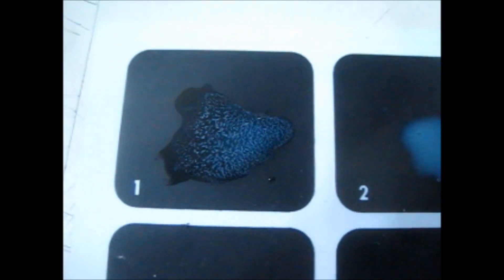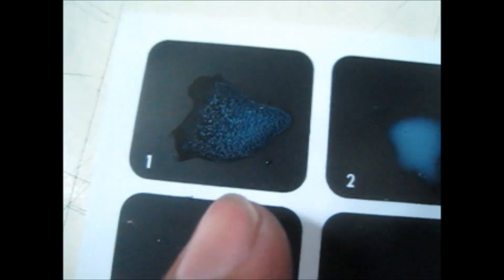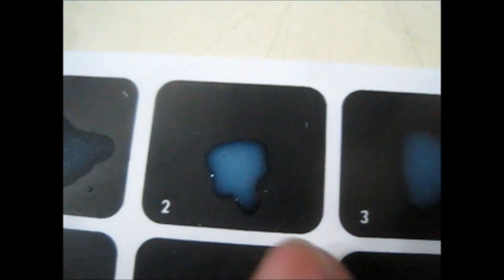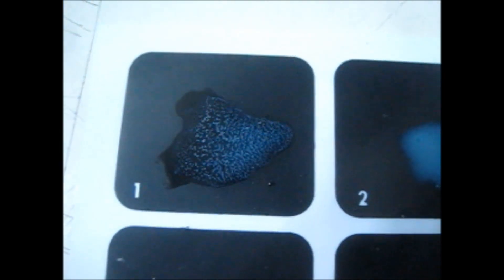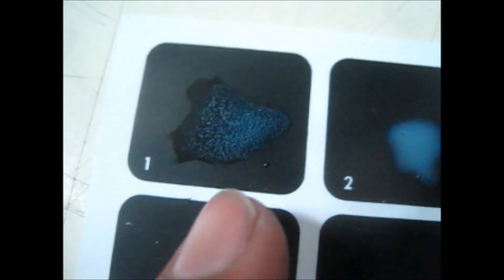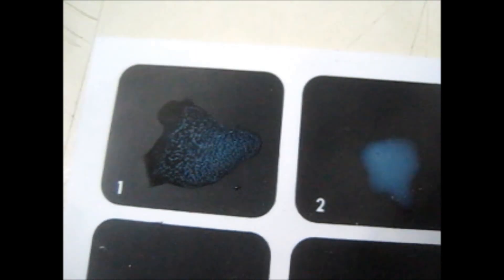Now you have the positive and negative controls. Compare the middle one with one and three, that is with the positive and negative. If it shows precipitate like number 1, the test is positive. If it looks like number 3, the C-reactive protein is negative in the serum. Thank you for your valuable time.